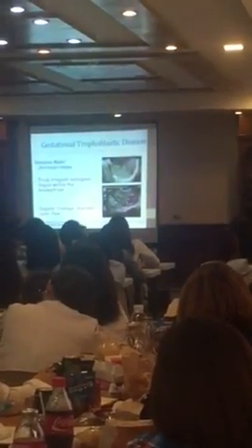So how do you now differentiate if it is an invasive mole or choriocarcinoma? Ultrasound cannot diagnose if it is invasive mole or choriocarcinoma. What we need is just to assess if it is GTN or GTD. And we have to differentiate it from AV malformation because you have the same presentation in ultrasound, meaning what will help you is your beta HCG.